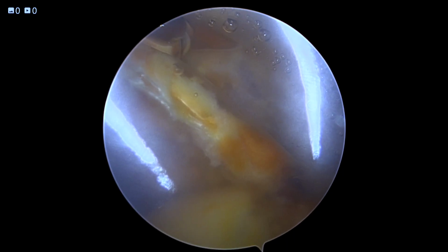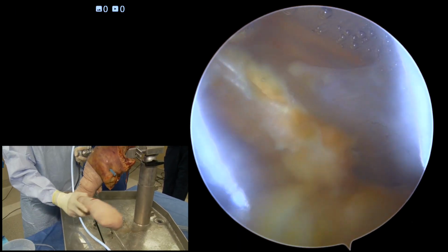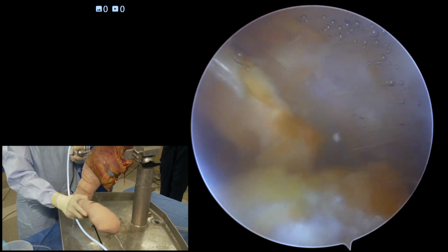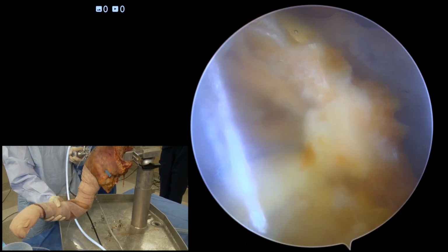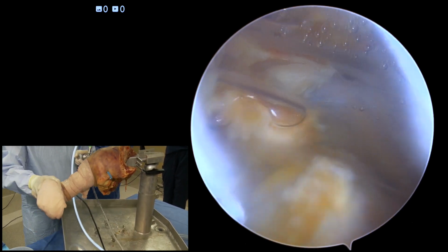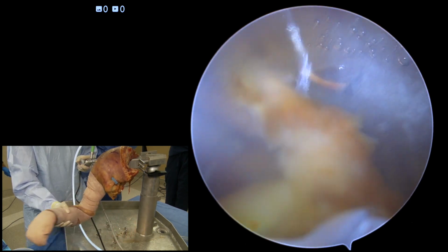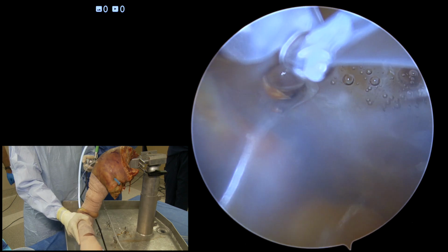Once we have the implant fully deployed within the subacromial space, I generally like to range the shoulder to make sure that the implant is in appropriate position and stable. You can see because of the clear nature of the implant, we can actually visualize the tuberosity through the implant itself. We work on gentle range of motion, both internal, external, abduction, forward flexion, and you can see the implant remains stable through range of motion, articulating between the humeral head and the acromion.